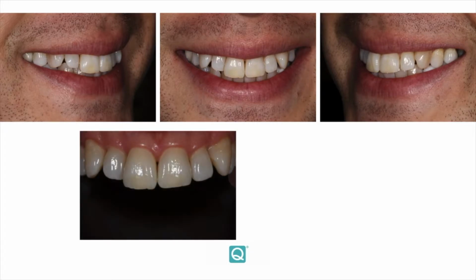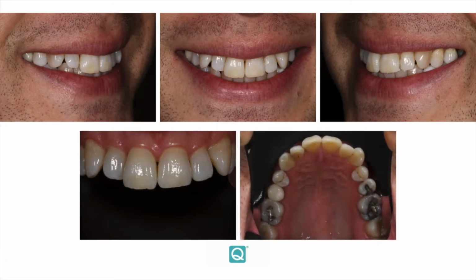So here's a close-up of the front teeth, and you can see a number of other things at this stage as well. Namely that we do have a black triangle between the front two teeth. The teeth are a little bit triangular in shape, and the front two teeth are not symmetrical either. From the occlusal photograph, you can see how much space we do need, and you can see that this upper left canine needs quite a lot of space, maybe 2 or 3 millimeters all in all, to align the teeth and not get any further proclination.